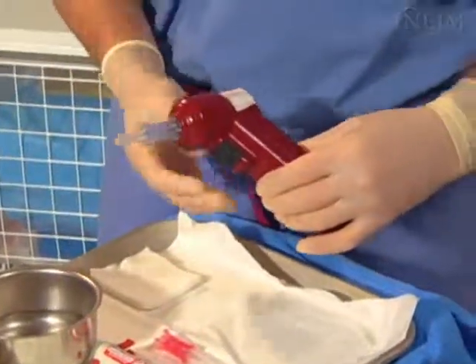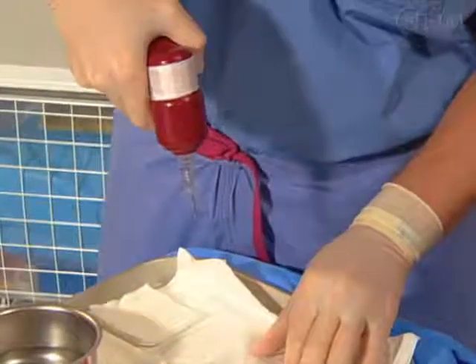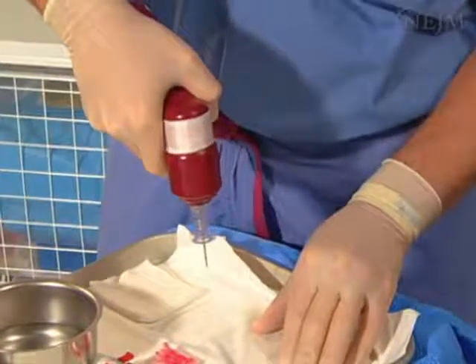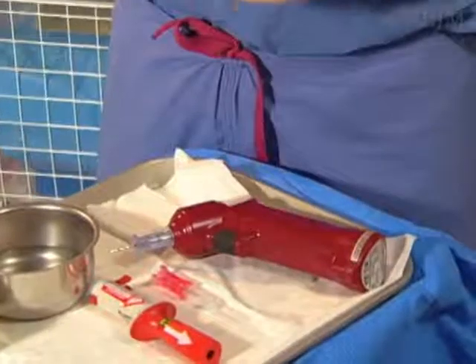The battery-powered driver and cutting needle facilitate penetration of the bony cortex, while the operator can control the depth of insertion by increasing or decreasing the pressure applied and by changing the length of time the drill trigger is depressed.